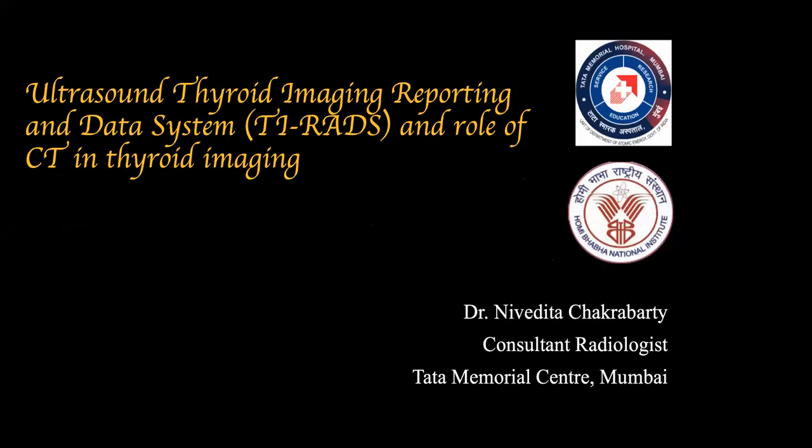Hi, everyone. I'll be predominantly speaking on thyroid imaging, reporting, and data system on ultrasonography and the role of CT in thyroid imaging. I'm sure you are well versed with the thyroid anatomy, that it consists of two lobes joined by an isthmus, so I'm not delving much into it. I'll be subsequently showing you images of ultrasound and CT, so you can see the anatomy there.